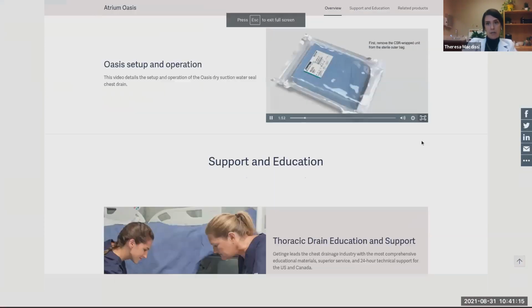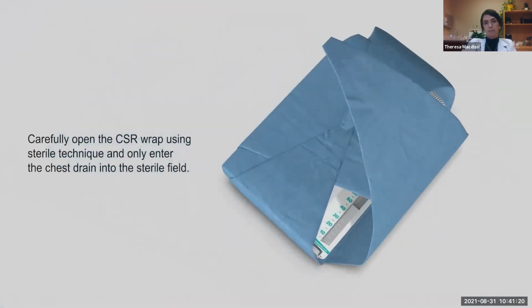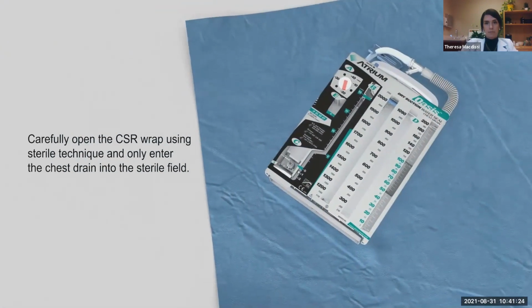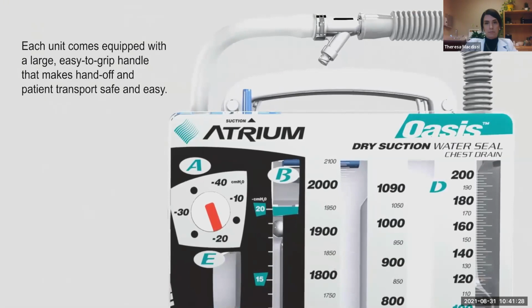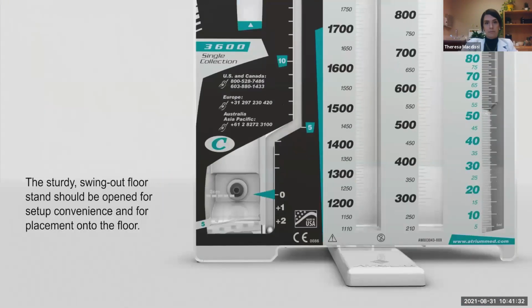First, remove the CSR wrapped unit from the sterile outer bag. Carefully open the CSR wrap using sterile technique and only enter the chest drain into the sterile field. Each unit comes equipped with a large, easy-to-grip handle that makes handoff and patient transport safe and easy. The sturdy swing-out floor stand should be open for setup convenience and for placement onto the floor.